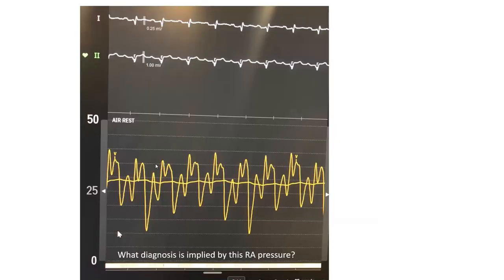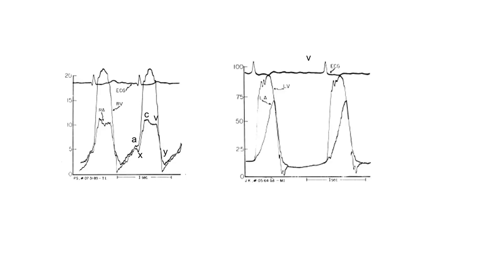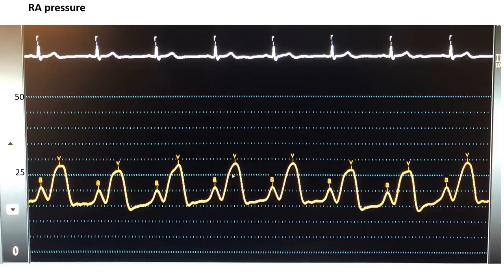You have a C-wave here and this is the true V-wave. But we call them fused CV-wave or plateaued V-wave. On the left, when you have MR, unlike in TR, you get a tall and late-peaky V-wave. You don't get the wide ventricularized V-wave because on the left, the LV pressure is much higher than the LA pressure — so much so that it's harder for LA pressure to approximate LV pressure than it is for RA pressure to approximate RV pressure. This is another illustration of a ventricularized RA pressure, where the V-wave is not only high but plateaued and rectangular, just like a ventricular pressure.